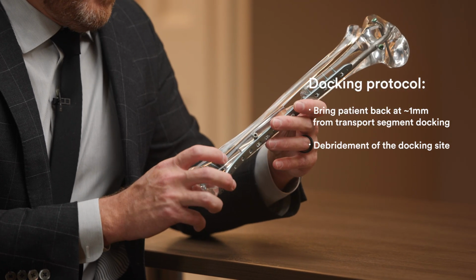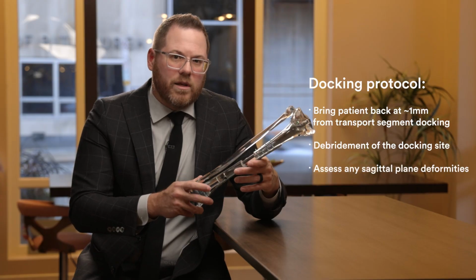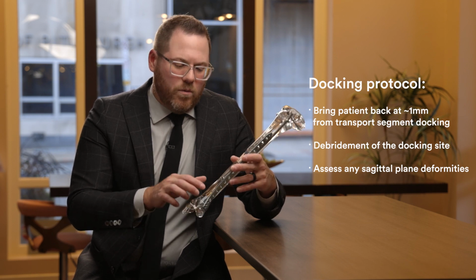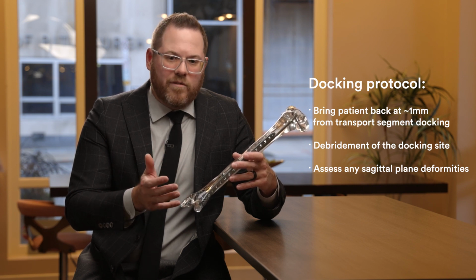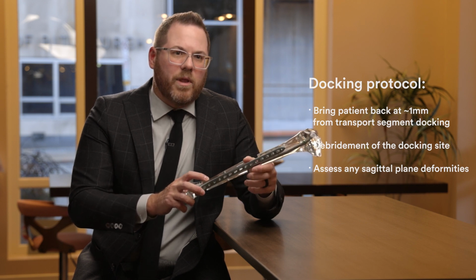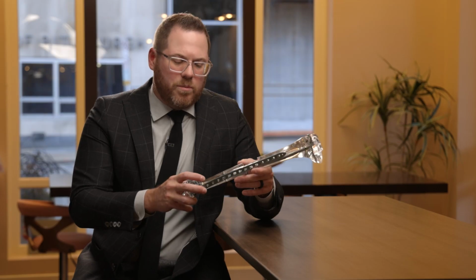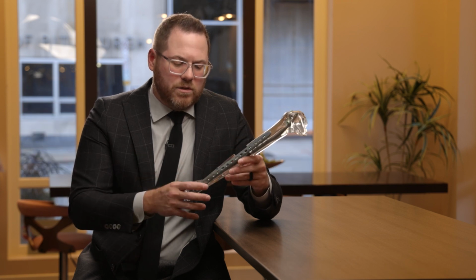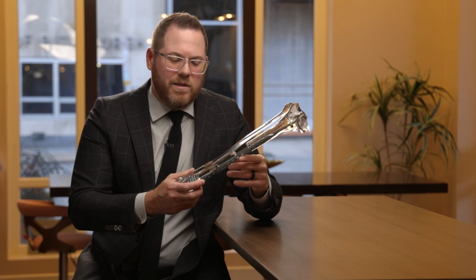In PABST, for patients with the antegrade push technique for a tibia, as there is sagittal plane deformity and we've planned for an intraoperative docking site procedure, we can make a small incision for clearing fibrous tissue at the docking site, bone graft as you see fit, but we're also able to control the sagittal plane malalignment through percutaneous techniques or a very small incision, guide this transport segment back in the appropriate position, and through another percutaneous incision can place a non-locking cortical screw into the segment to help maintain the position.